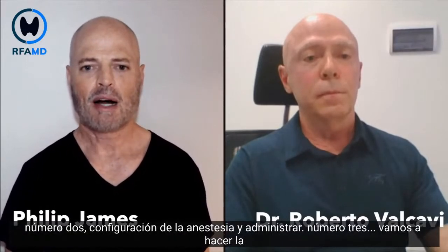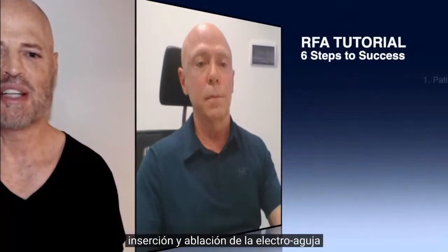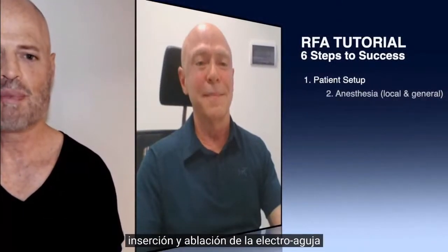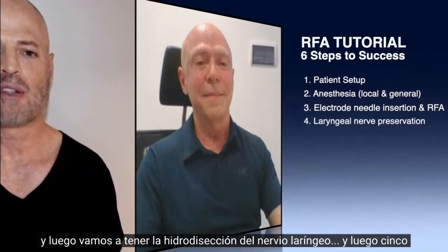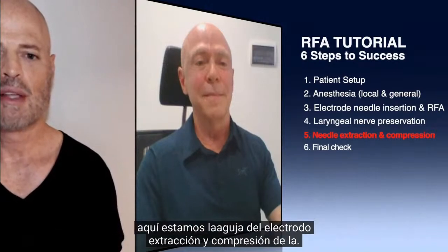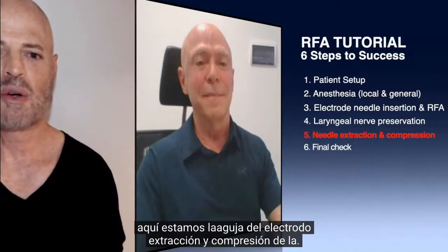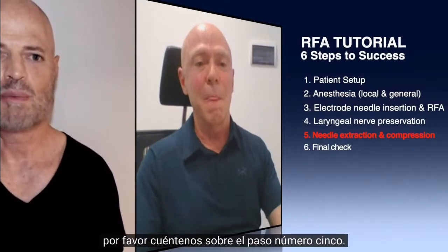Yes. Let's go over the steps again. Number 1, we're going to set up the patient. Number 2, anesthesia setup and administer. Number 3, we're going to do the electrode needle insertion and ablation. And then we're going to have the laryngeal nerve hydrodissection. And then 5, here we are, the electrode needle extraction and compression. Please tell us about step number 5.